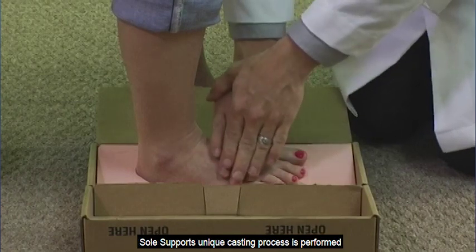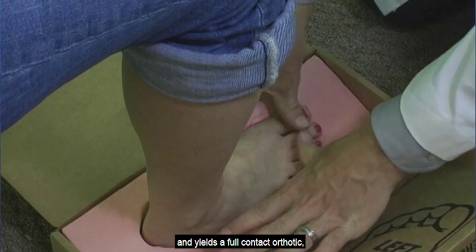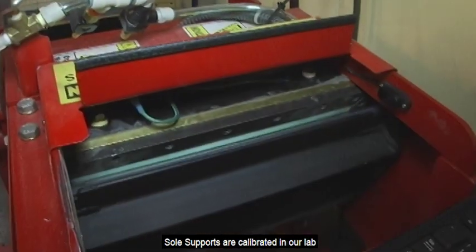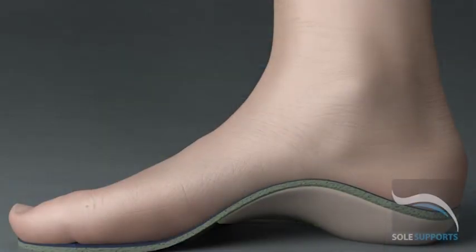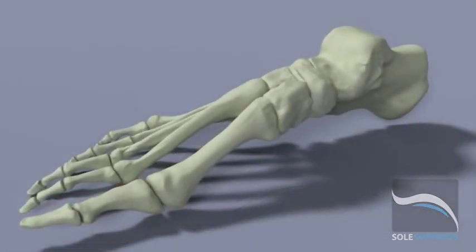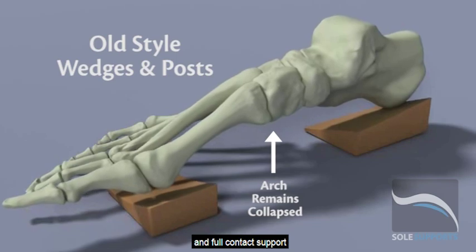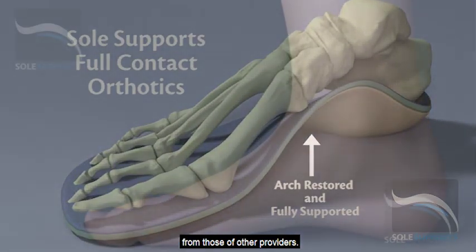Sole Supports unique casting process is performed by a certified professional and yields a full contact orthotic fitting exactly to your unique foot structure. Sole Supports are calibrated in our lab to within two thousandths of a millimeter, so that they flex specifically to your body's weight, foot flexibility, and your activity level. It is this customized calibration and full contact support which distinguishes Sole Supports orthotics from those of other providers.